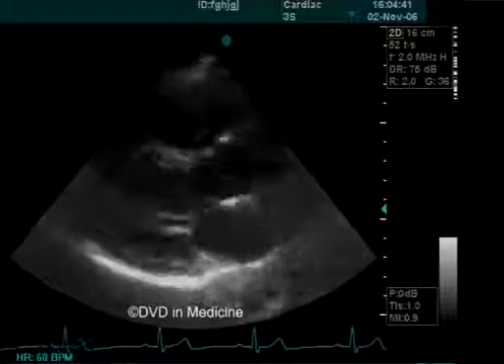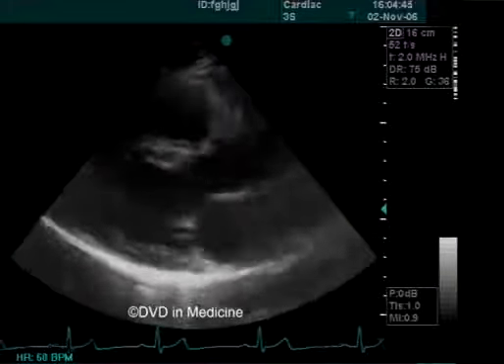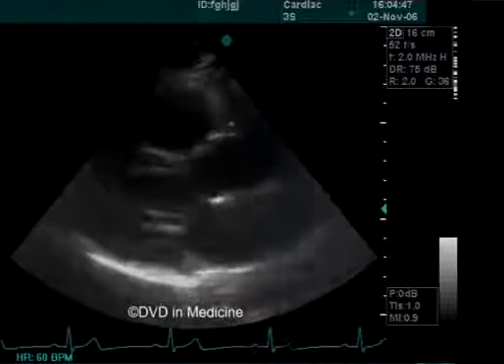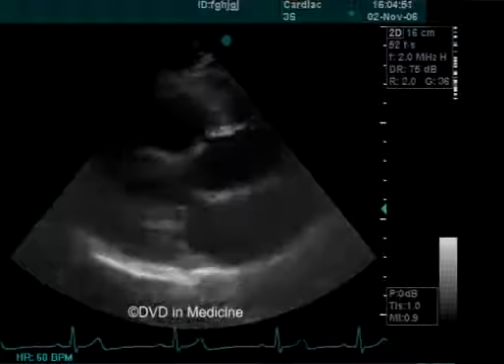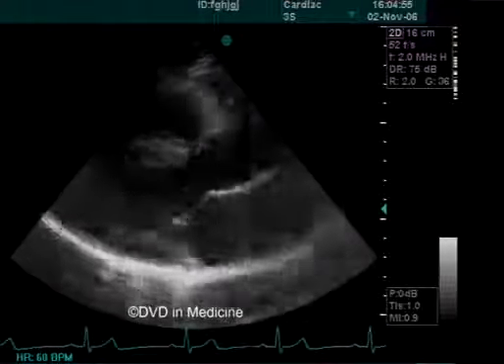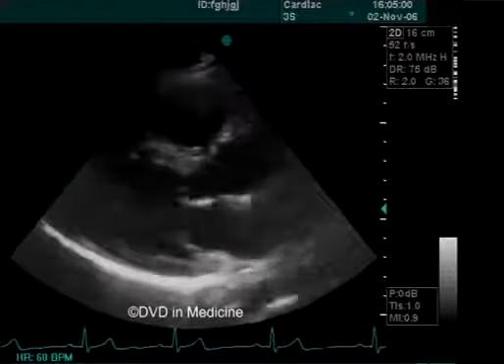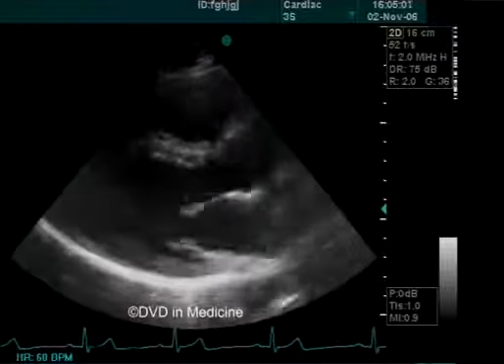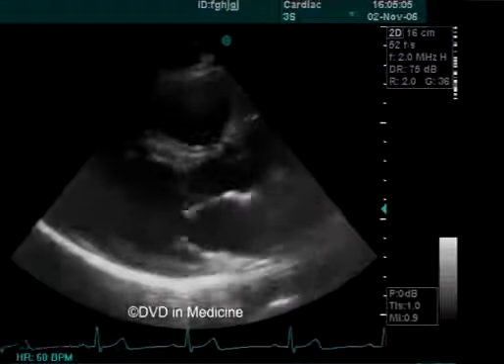2. To diagnose aortic valve pathology, anomalies, calcinosis, vegetations, thickening. 3. To diagnose subvalvular left ventricular outflow tract obstruction, membranous or muscular stenosis. 4. To assess left ventricular systolic function. 5. To determine the amplitude of motion and thickness of the interventricular septum and posterior left ventricular wall.